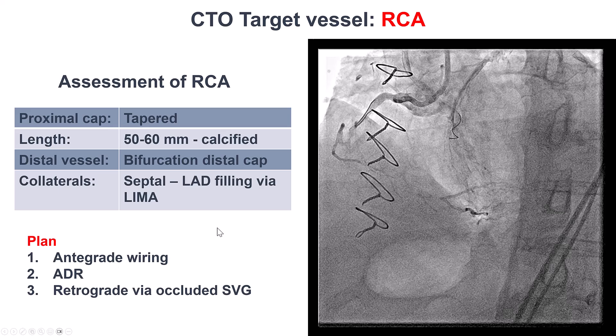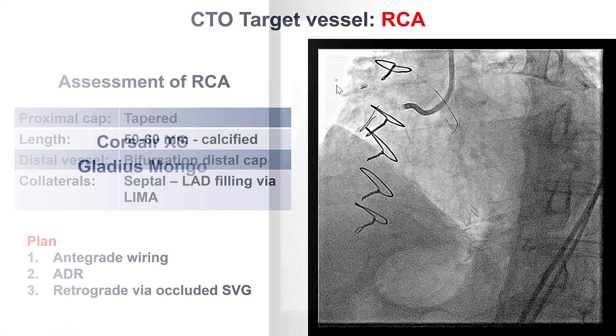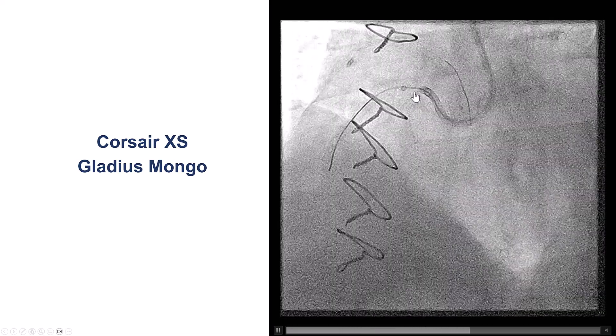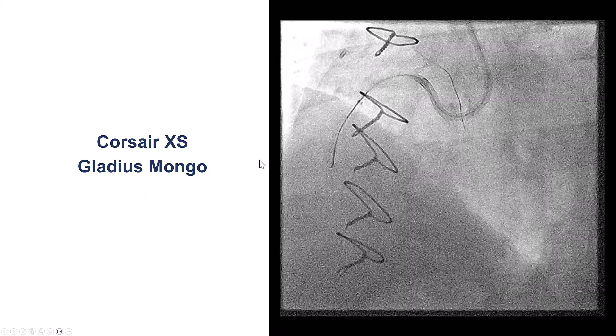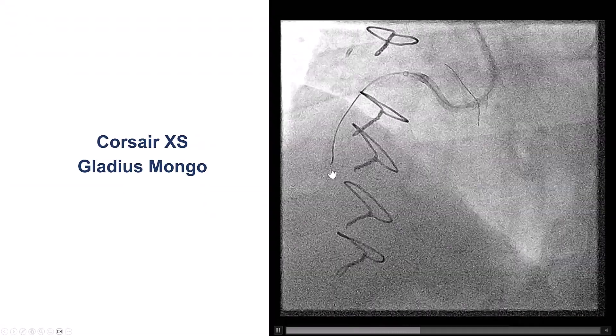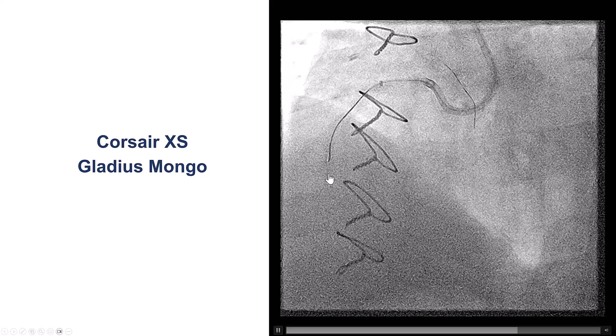Our plan was to try antegrade wiring and ADR, and also try retrograde through the occluded saphenous vein graft. We used an AL-1 guide, a 7-French Trapliner, Corsair XS, Gladius Mongo, and we literally could not advance the wire past the proximal cap. We also used a Gaia NX2 — we just could not penetrate through the proximal cap.